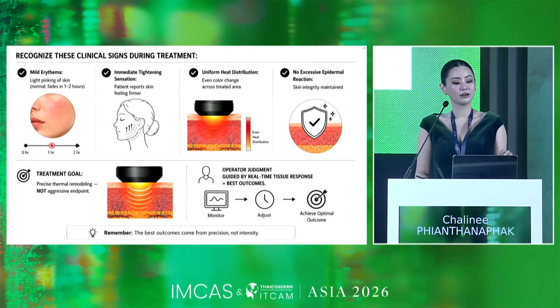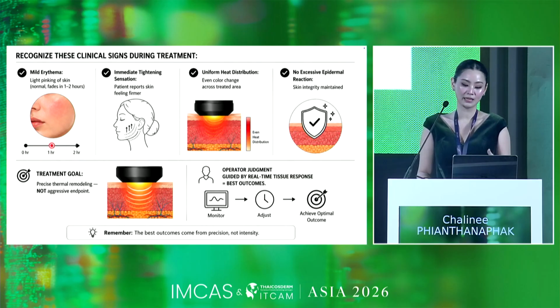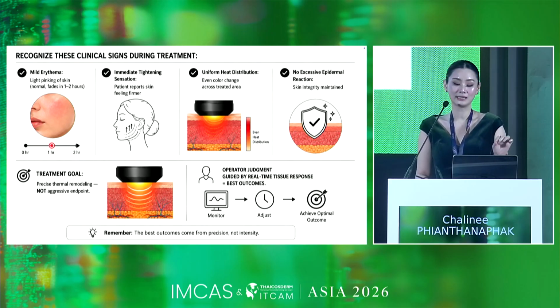So recognize these clinical signs during the treatment. We can see mild erythema that occurs during the treatment, but it will resolve quickly, and an immediate tightening sensation that the patient can report, and feeling firmer after the treatment. And the patient must feel uniform heat distribution, not a focal hotspot, because our goal is control, not aggressive remodeling.